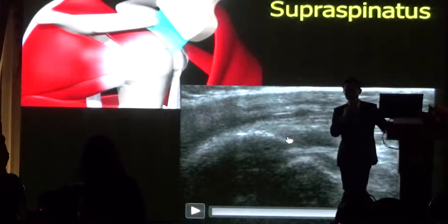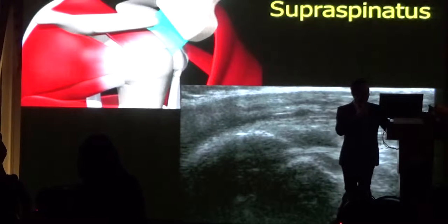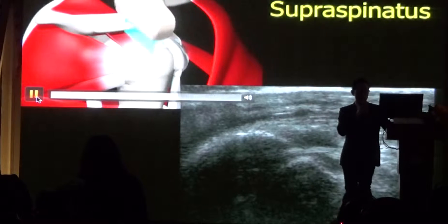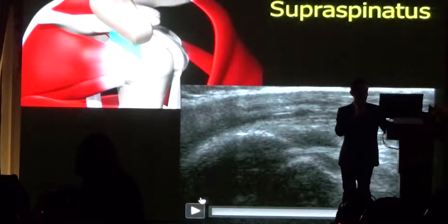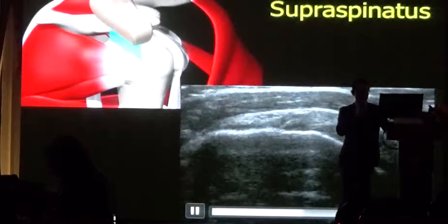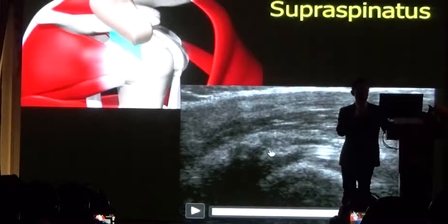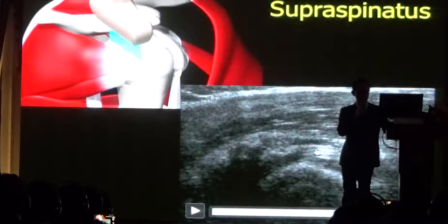The most important of the rotator cuff tendons is the supraspinatus tendon, and this needs to be evaluated from its front border right through to its posterior border. You can see on the coronal images here that the superior border of the supraspinatus has a convex appearance, and I know that I've covered the entire tendon because anteriorly I can see the long head of biceps, which is this structure over here.